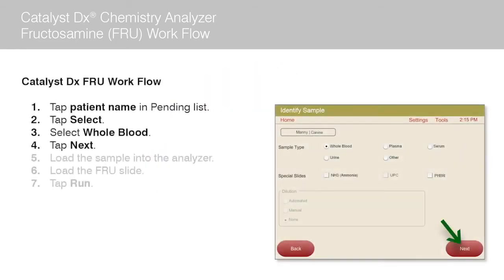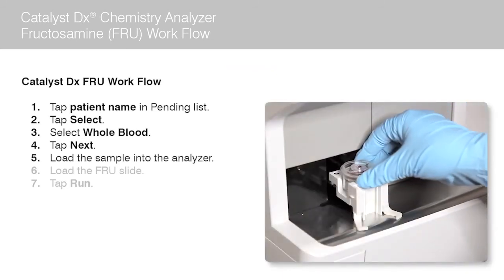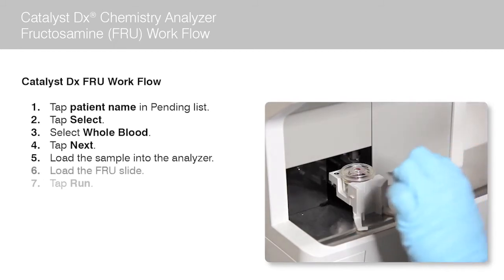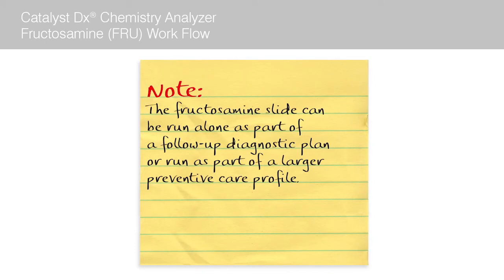Now tap next. The sample drawer opens. Load the patient sample into the analyzer. Next, load the fructosamine slide. Note: the fructosamine slide can be run alone as part of a follow-up diagnostic plan, or run as part of a larger preventive care profile.